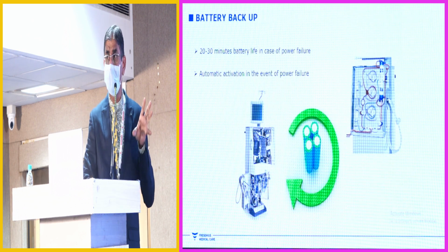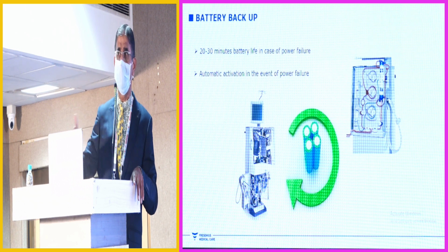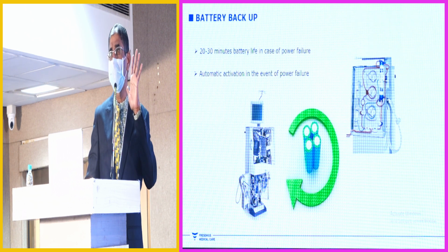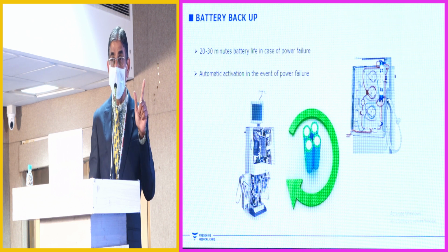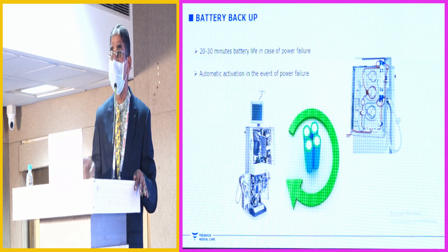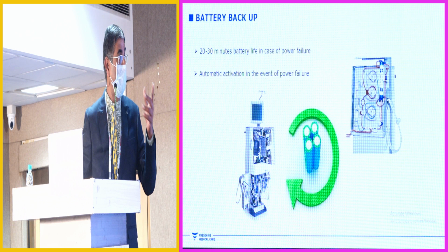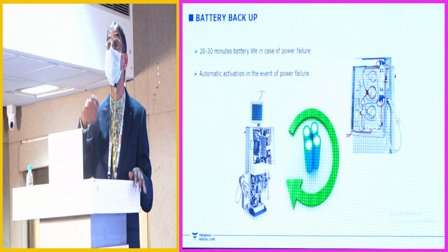Battery backup is there for the engineers, which a lot of companies come with at 30 minutes, 25 minutes. I would say 15 minutes is ideal. That means for 10 minutes you can run the pump. That means dialysis doesn't take place. It's just the blood pump which is rotating to keep the blood moving freely, not clotting. And that 5 minutes buffer is to return the blood.